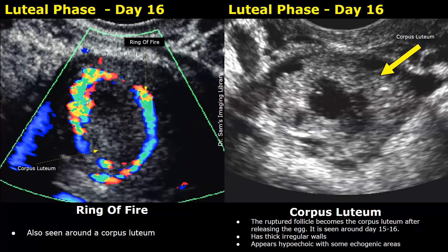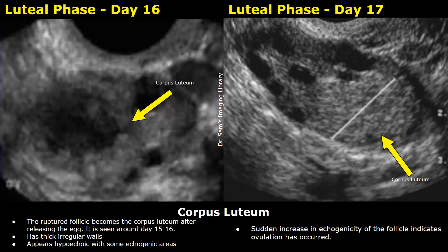On color Doppler ultrasound, the corpus luteum also shows a ring of fire peripheral vascularity. The corpus luteum, which appears as a structure with irregular thick echogenic walls, will show increased vascularity at its periphery. This is another image showing the corpus luteum on day sixteen. The image on the right is taken on day seventeen. The corpus luteum can also appear completely echogenic — this sudden increase in echogenicity of the dominant follicle indicates that ovulation has occurred.